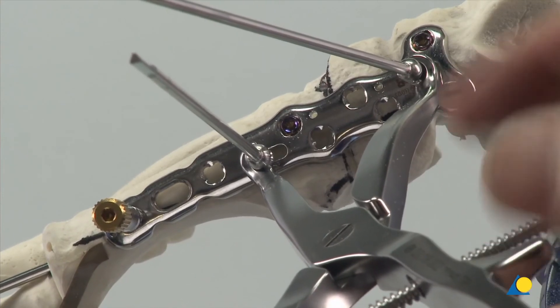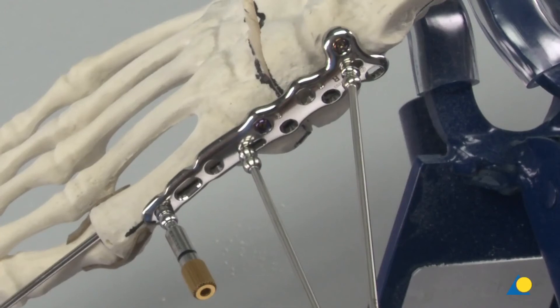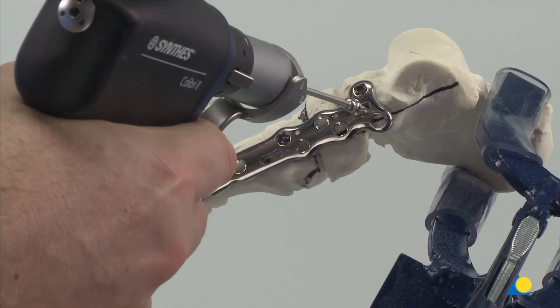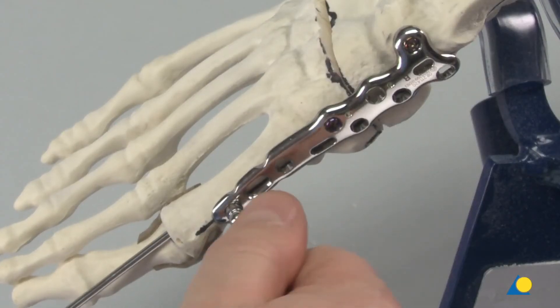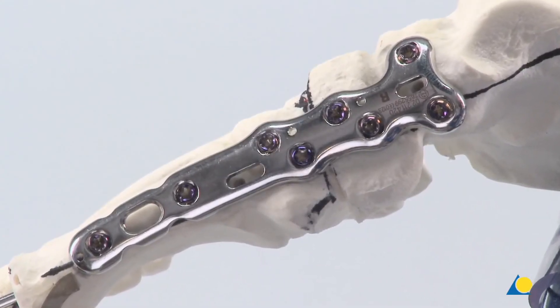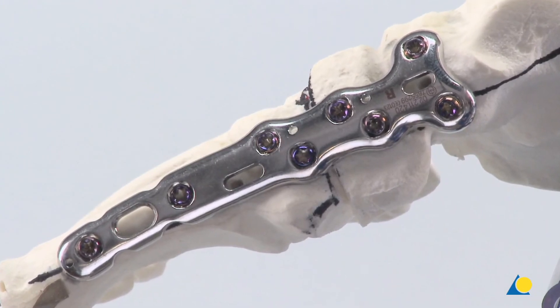The compression forceps are removed. The compression wires are withdrawn. The compression-distraction rod is unthreaded. The remaining plate holes are filled with 3.5 mm VA locking screws, and the completed construct is shown here.